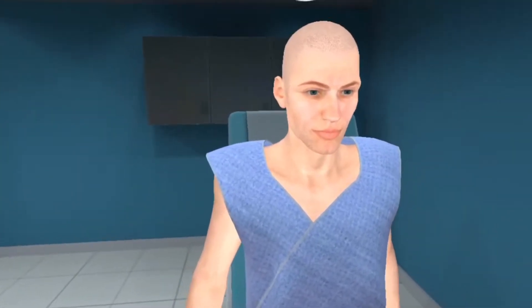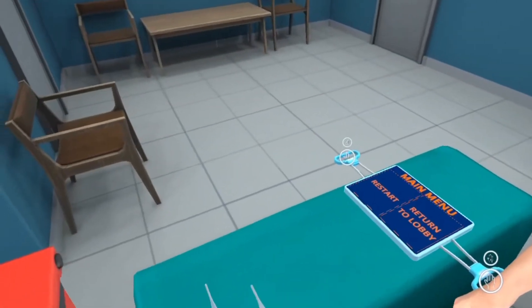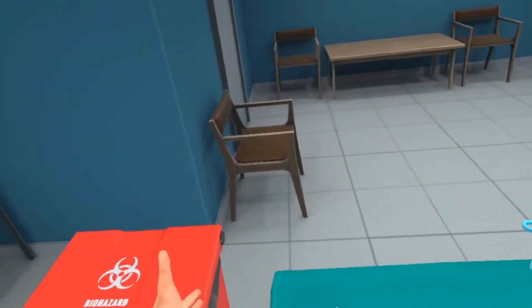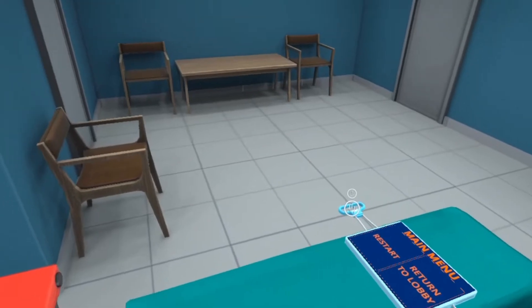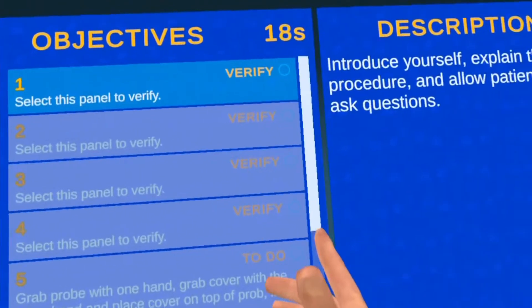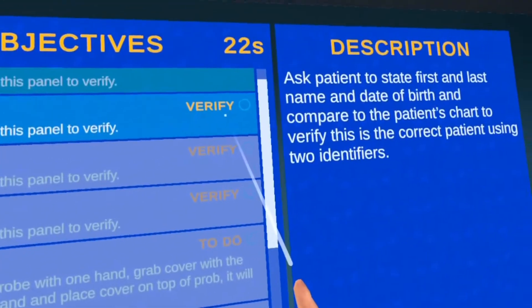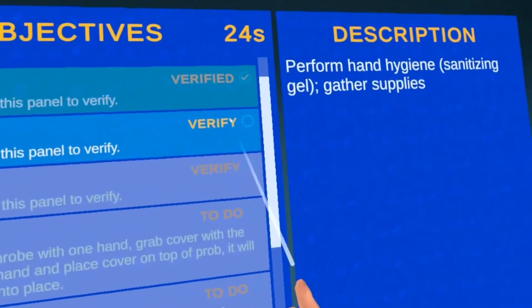In this scenario we're taking the patient's temperature. The patient is sitting, and you have your temperature probe and trash bin — that's all you're going to need to take the probe that was in the patient's mouth and throw it away. You start the procedure the same way: introducing, verifying, understanding, and educating the patient on what you're going to do, then gather your supplies.